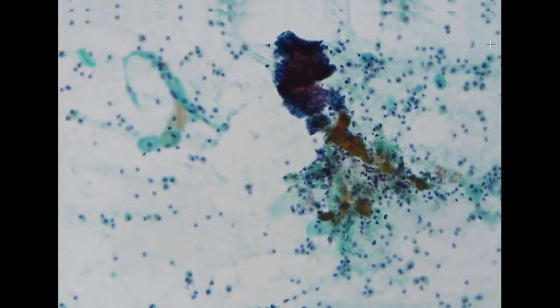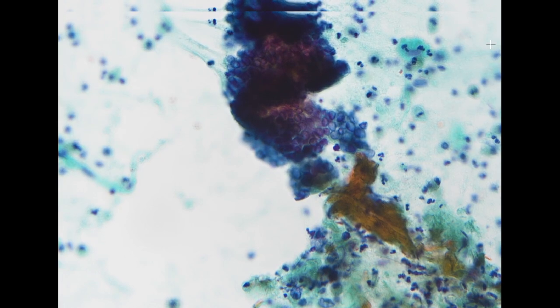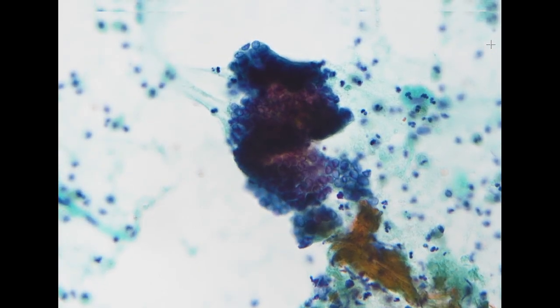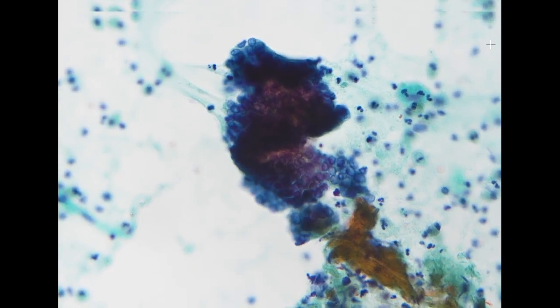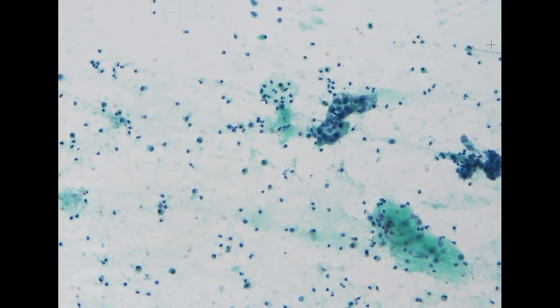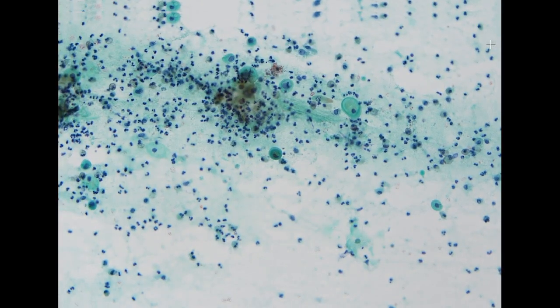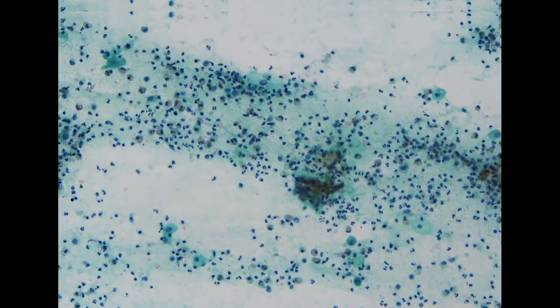For this type of specimen, the patient has already received treatment, and it can be admixed with a lot of reactive changes because of the cone biopsy, and the tumor or lesional cells might be a little bit scant. So it's kind of difficult to appreciate the prominent tumor diathesis pattern, as we would see in an untreated primary adenocarcinoma of the endocervix. But here we do highlight these highly atypical glandular cells, and some of the cells also show prominent nucleoli along with a background necrosis pattern.